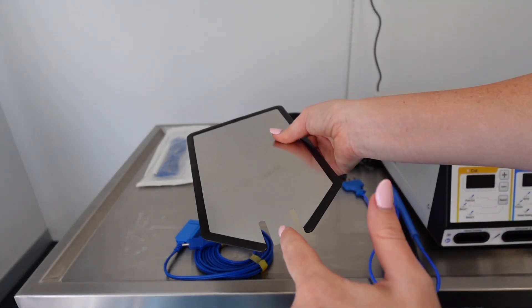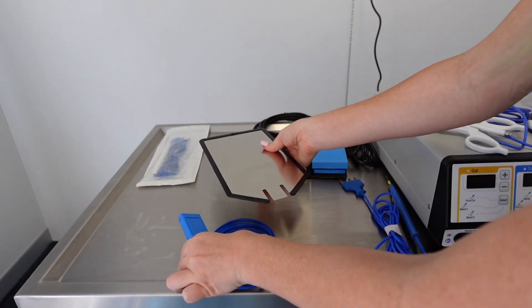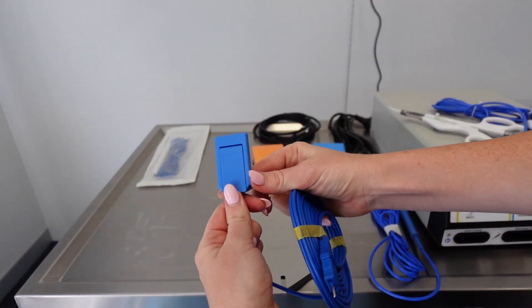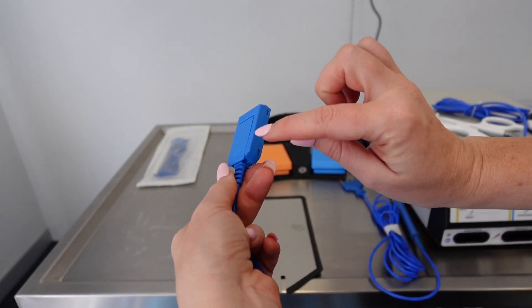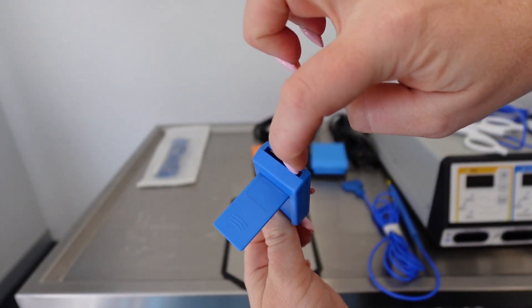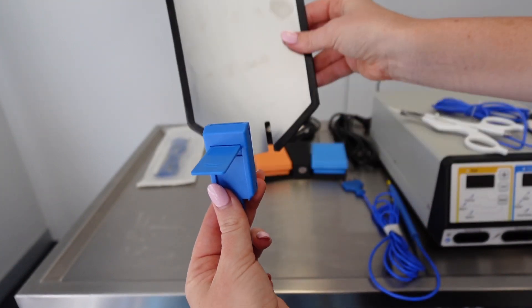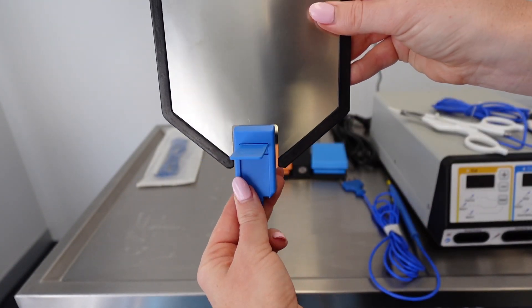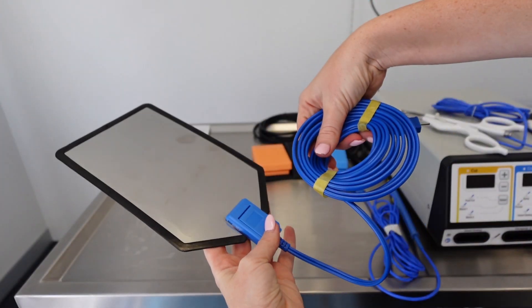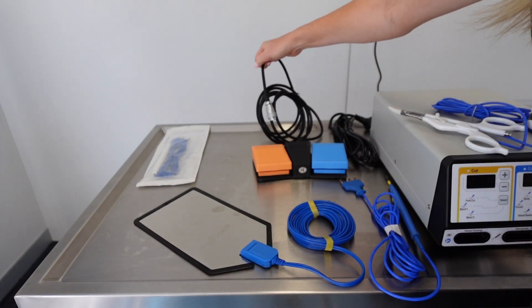This is your negative electrode plate, which is going to conduct the cutting and sealing instrument. This plate needs to be under the part of the patient that you are working on. This is the attachment that connects the plate to the unit — you lift up the little clip and slide that small piece on the plate into it, then press the clip down to clamp onto the plate. So that plate goes under the patient.